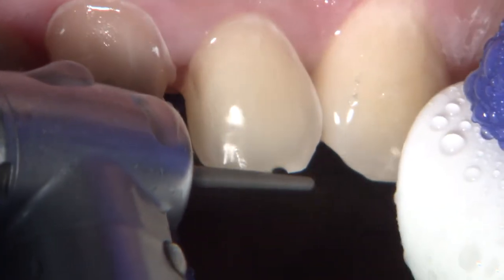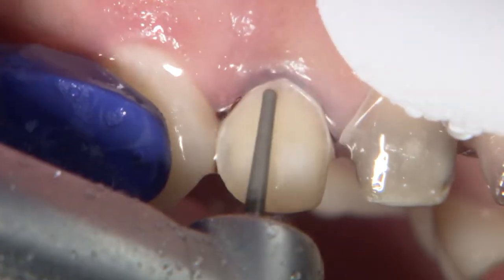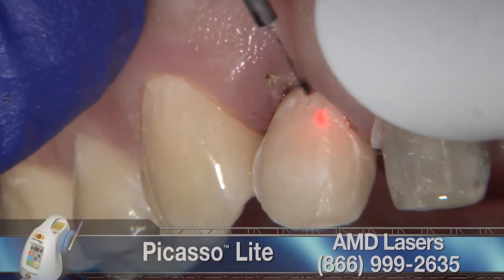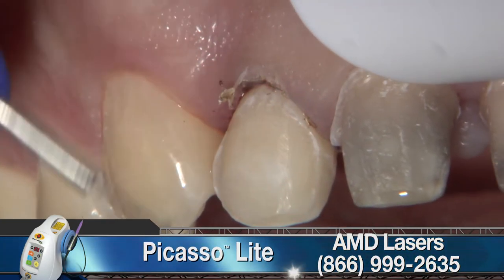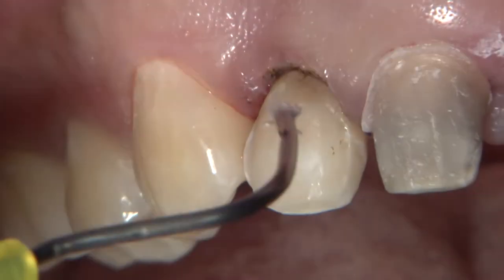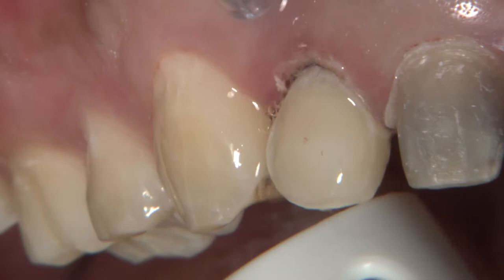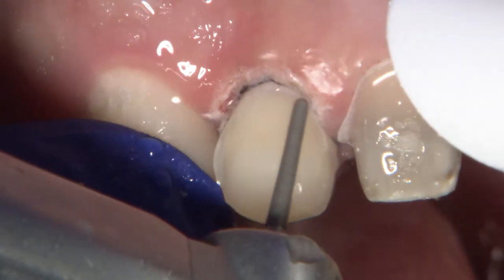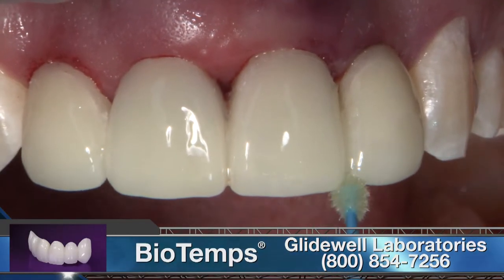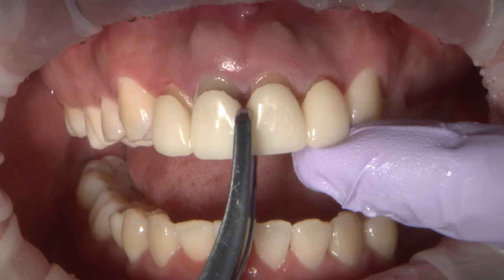With a diamond burr, all depth cuts were leveled until the surface enamel was smooth. A bone-sounding probe from Salvin Dental was used to confirm that 0.5 mm gingival recontouring on number 7 will not violate the biological width. The Picasso diode laser, with an initiated tip set for 1.8 watts at a continuous wave, was used to remove the excess tissue. Hydrogen peroxide loaded in an ultra-dense syringe was scrubbed gently into the tissue to remove the laser char. After repositioning the preparation finish line to the new gingival level with a fine diamond burr, a new set of CAD/CAM fabricated temporaries were placed and the patient was dismissed for two weeks to allow the tissue to heal before the bleaching procedure.